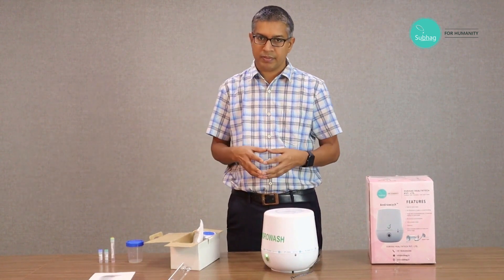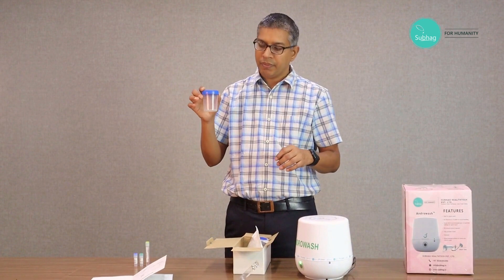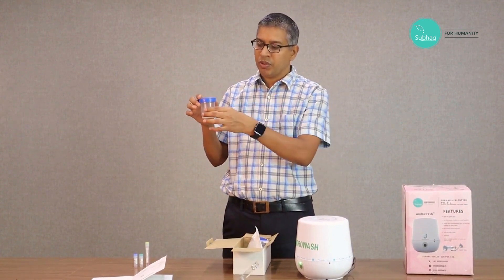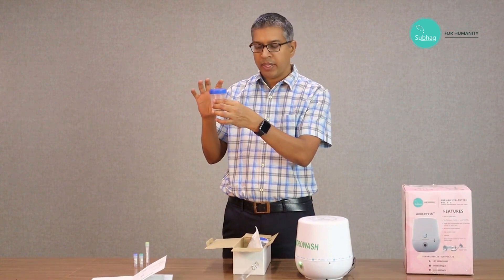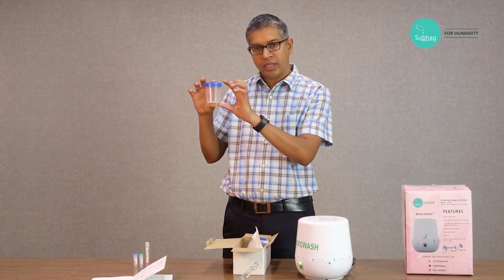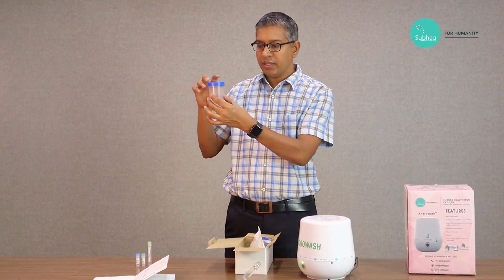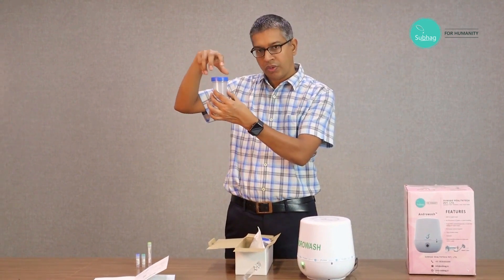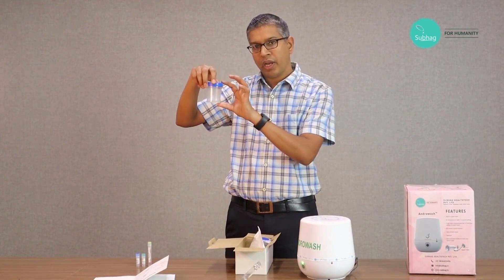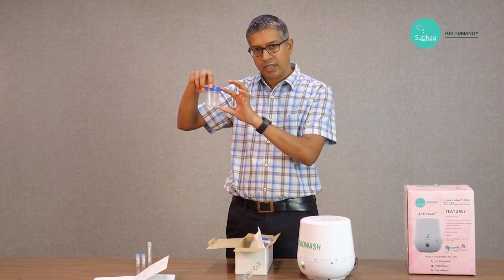As step number one, first what we need is the semen sample. The husband is provided with a sterile container, he ejaculates into this, then the cap is put back onto it. This is then left at room temperature for half an hour so that it gets liquefied.